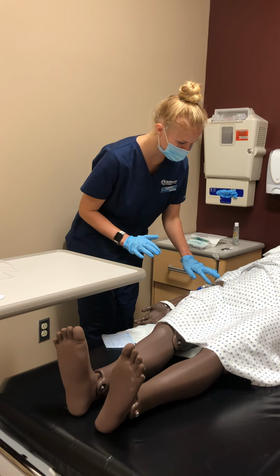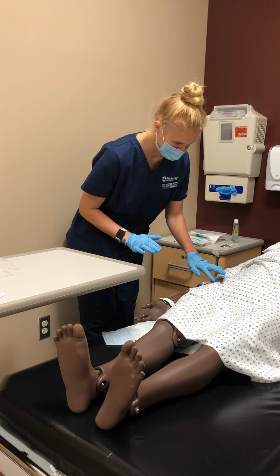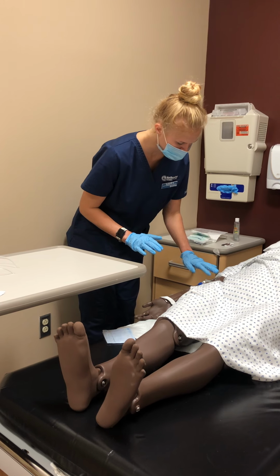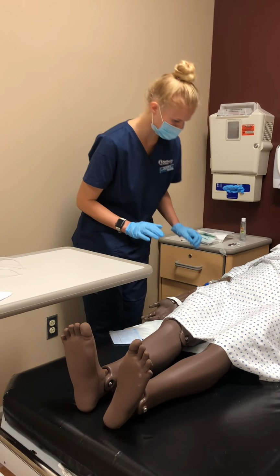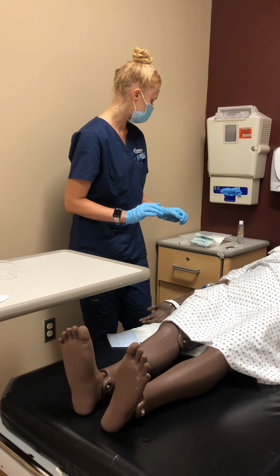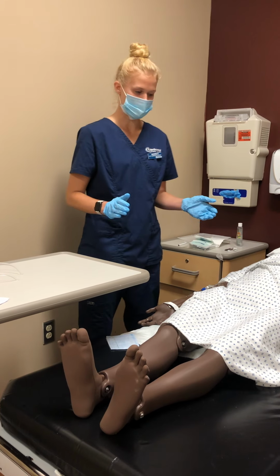I'm also going to check for REDA. So redness, there's none. Edema, none. Ecchymosis, none. Drainage.